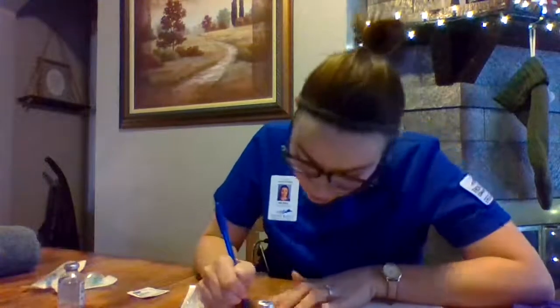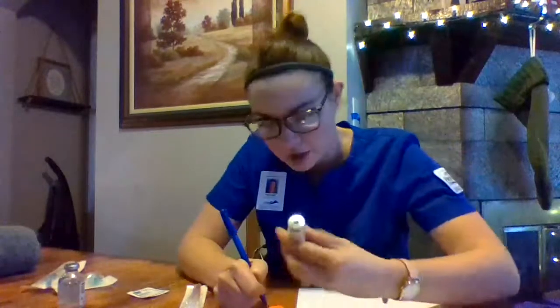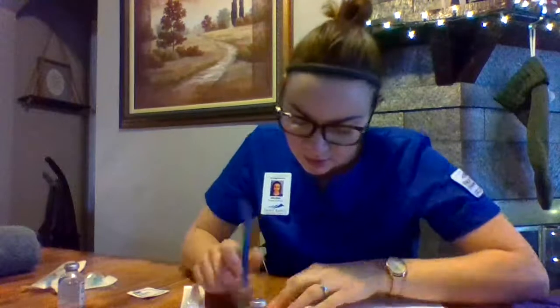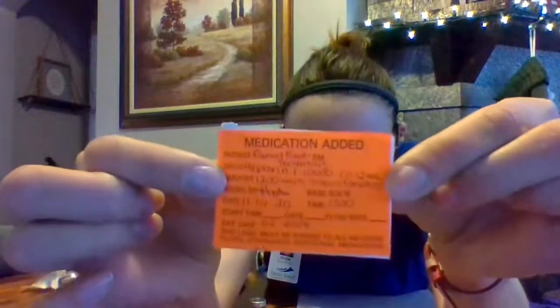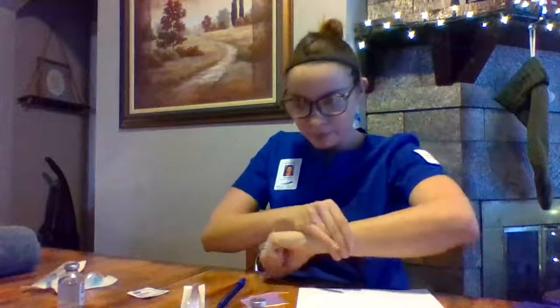Added by me, 11/16/20 at 1 o'clock p.m., 1300. And this medication expires on 2/28. Have all that. Now I'm going to get ready to draw up my medication. I'm going to open the lid of my vial and clean it with an alcohol swab for 15 seconds.